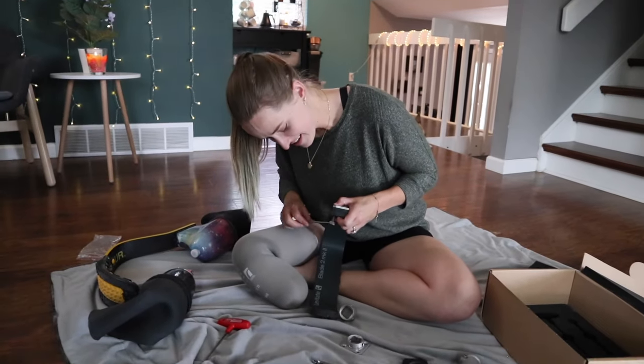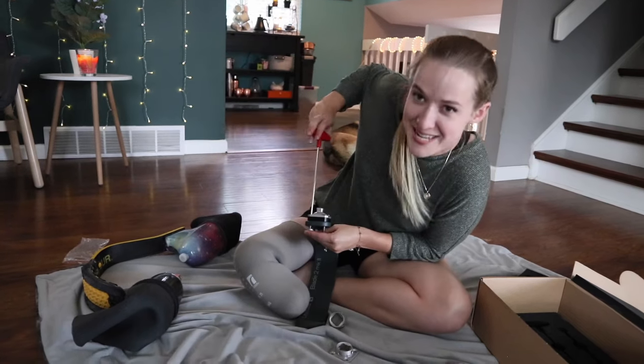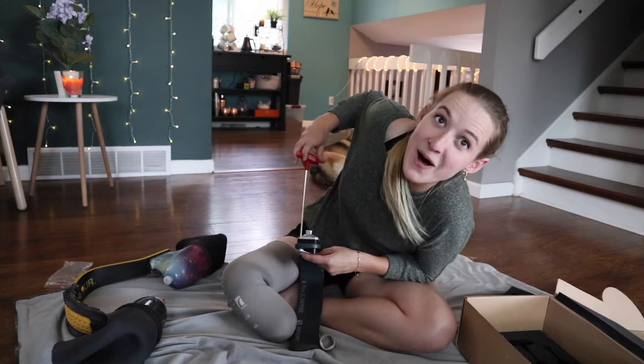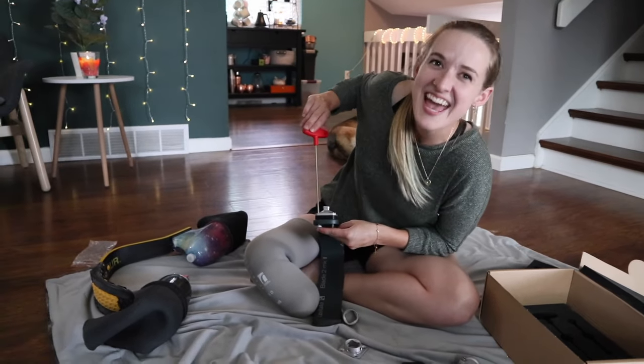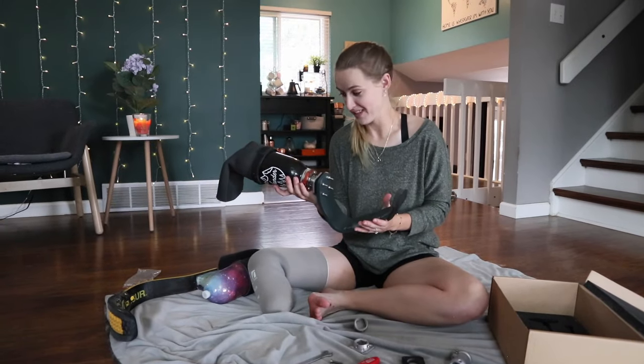The easiest way to do it is to hold that wrench steady and then use the allen wrench and twist the nut — any man lessons with Lori. Four years in the Army Corps of Engineers will do that. I think we have assembled it properly.